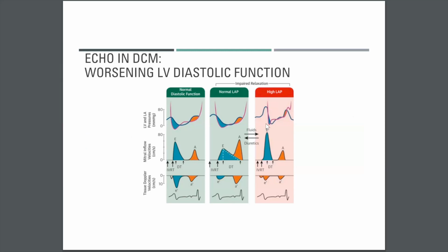So you have this rapid filling of the ventricle, and then as you move towards end diastole, the ventricular pressure equates to left atrial pressure, and in some cases actually slightly exceeds left atrial pressure, which is why your atrial contribution in diastole becomes very minimal. That's why your E/A ratio is greater than 2. And because you have this rapid filling and rapid stop of your early diastolic filling, that's why you have a quick deceleration time on the E velocity on the mitral inflow.